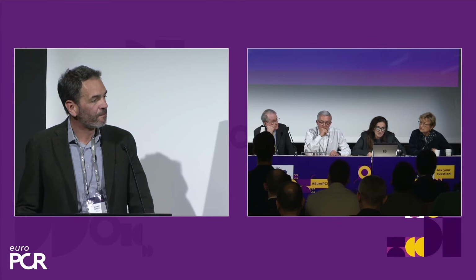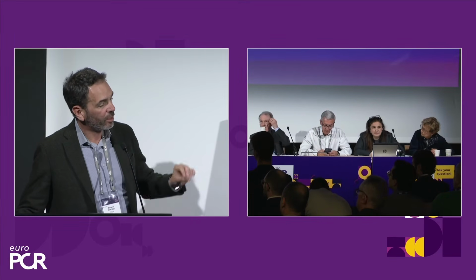There is a question here from an anonymous person who says, would you expect the same result as in Andromeda for larger vessels greater than 3 millimeters? I think so. I don't expect particular problems if we apply a good technical preparation and we just deliver the drug, which is the way a DCB should be used in the end.